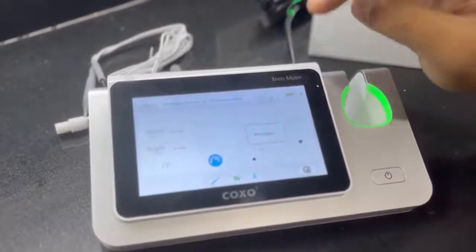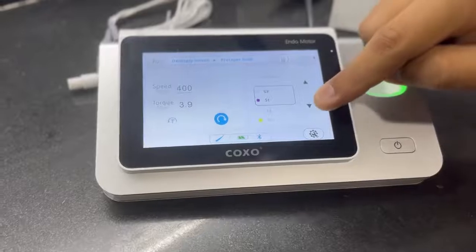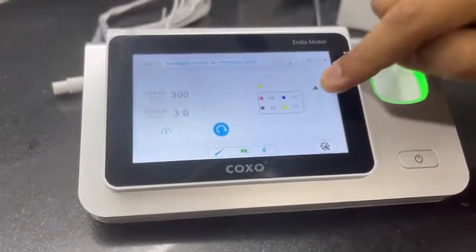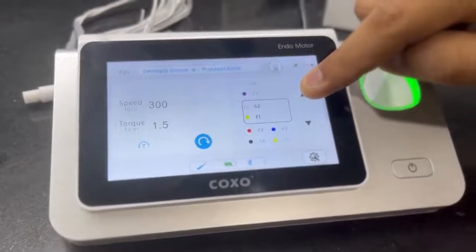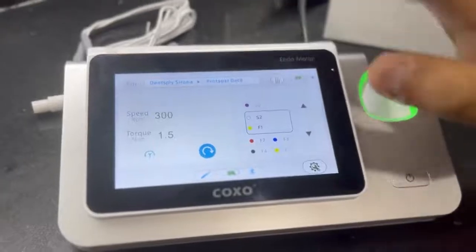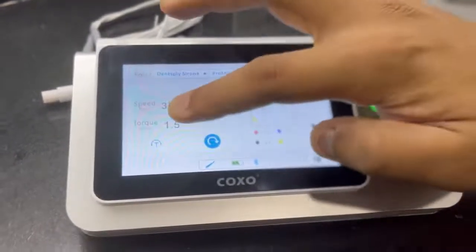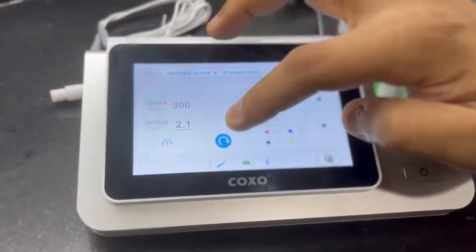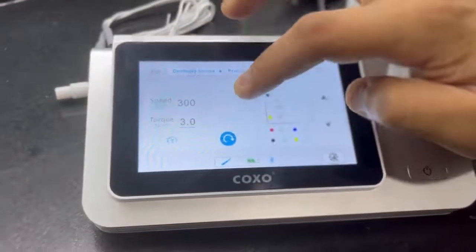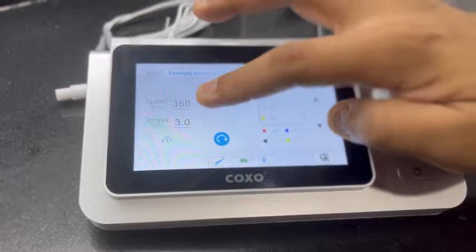So once I choose the file system, I choose the tick over here and you can see all the files that are pertaining to this particular file system are already displayed here along with their recommended speed and torque settings. Now if I need to change any of these, I can just add or subtract the value to increase or decrease the speed.